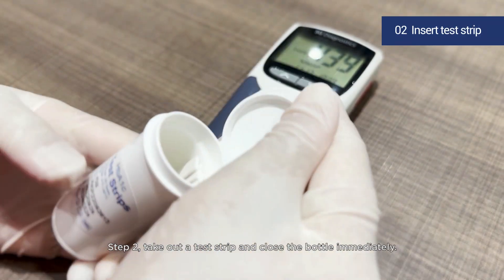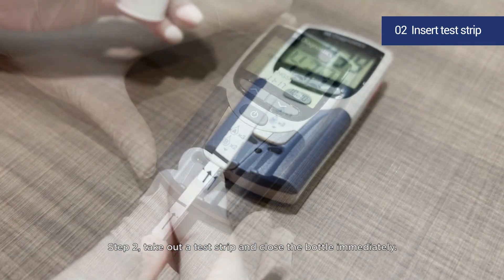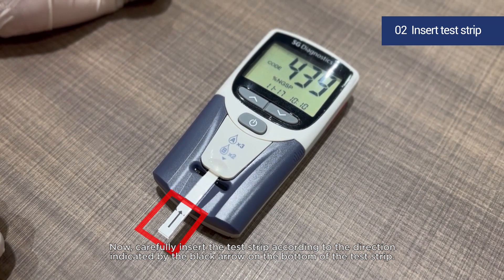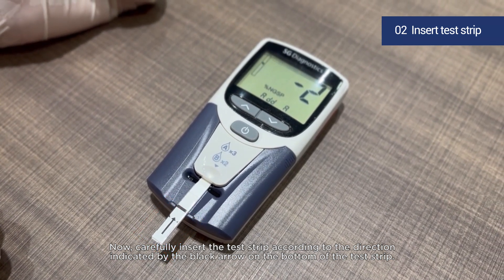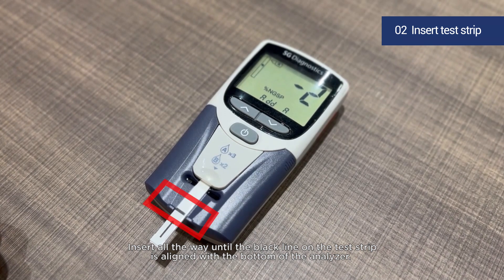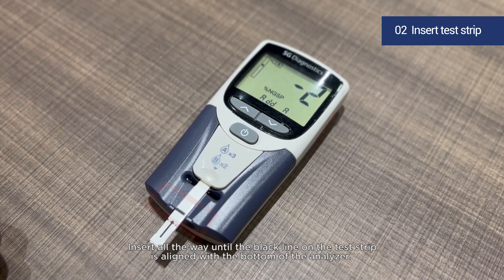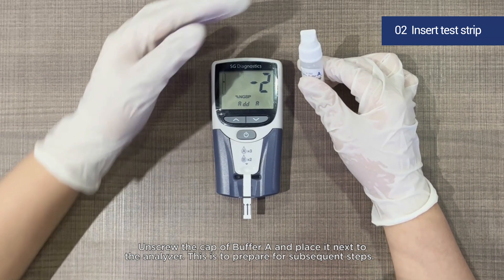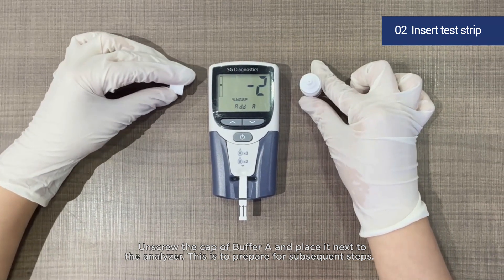Step 2: Take out a test strip and close the bottle immediately. Carefully insert the test strip according to the direction indicated by the black arrow on the bottom of the test strip. Insert all the way until the black line on the test strip is aligned with the bottom of the analyzer. Unscrew the cap of buffer A and place it next to the analyzer — this is to prepare for subsequent steps.